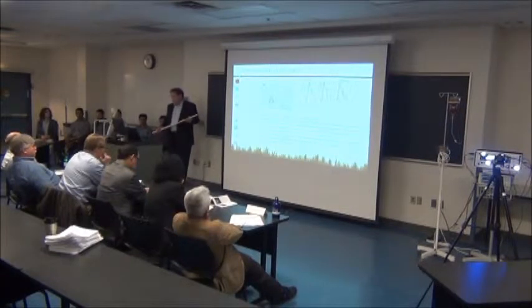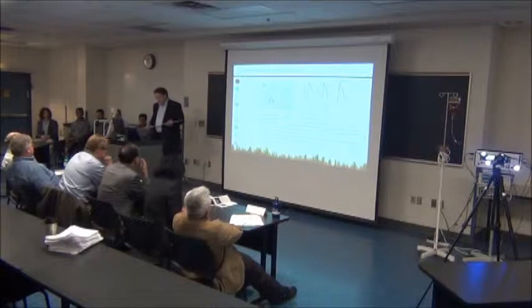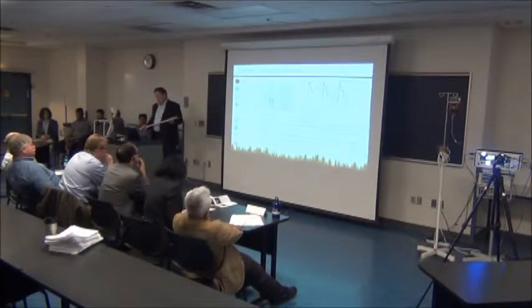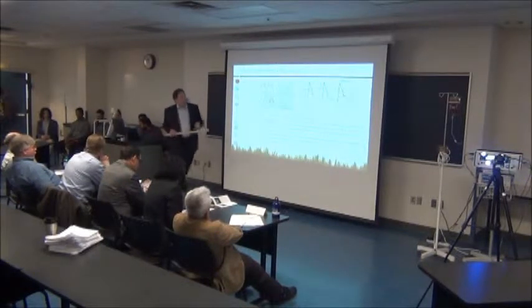Calibration, adjustable gain. Once the zero is set, the gain has to be adjusted. For example, the pump is pumped until 80 millimeters of mercury of pressure is applied to the transducer. The transducer will produce a voltage, for example 8 millivolts. We want to amplify this to the proper amount, so it's displayed as 80 millimeters of mercury on the monitor. For this example, we would adjust the gain to 100 times, giving an 800 millivolt output displayed as an 80 millimeters of mercury line on the monitor. An adjustable gain knob is used for this.